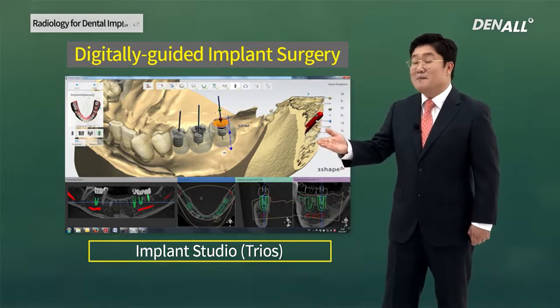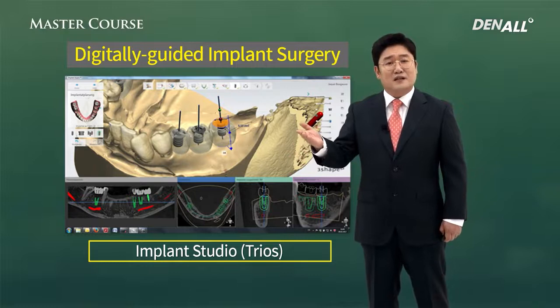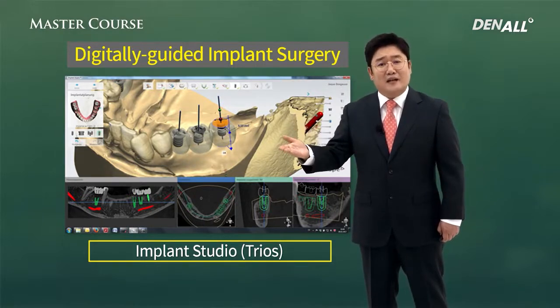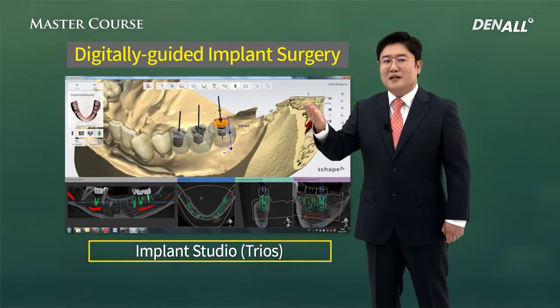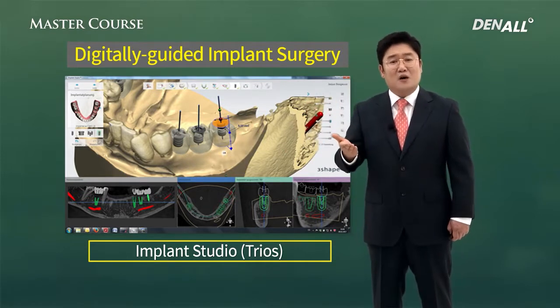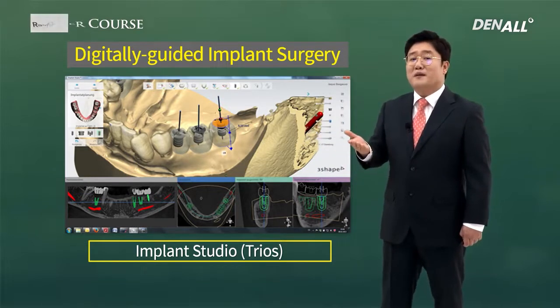I believe you have heard about this many times, but such planning, digitally guided implant surgery planning, requires a CBCT as a must.